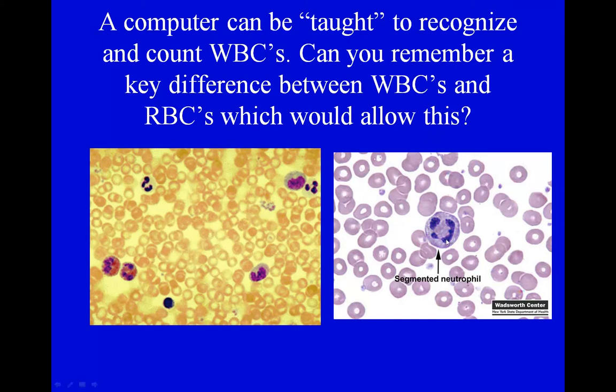Can you see though why they would call this one a segmented neutrophil? And so if you have your paper in front of you that talks about neutrophils, there are two types of neutrophils. There are band neutrophils, which are sometimes called stabs, most commonly designated as bands. There are segmented neutrophils or mature neutrophils. Some people call them segs. And do you see how the computer could tell the difference between a segmented neutrophil or one that's maybe just all joined together?